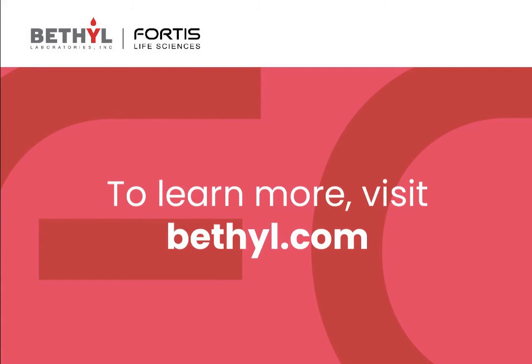Great, thank you, Mike. So next question, what are the advantages of using an amplified system such as Opal? That's a great question, and the biggest advantage is an increase in your signal to noise ratio. So the amplification by Opal or other tyramide systems really allows you to boost your signal up to a usable level. That's the first advantage. The second advantage is it allows you to use antibodies from the same host species.